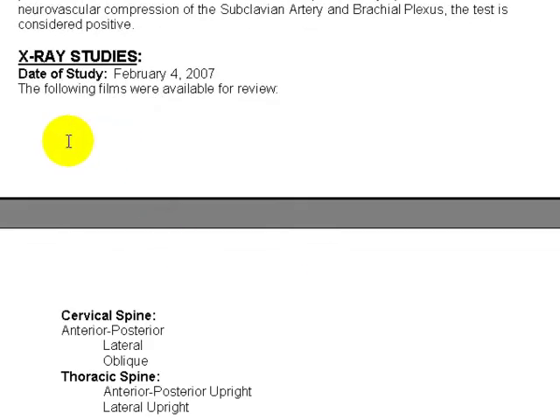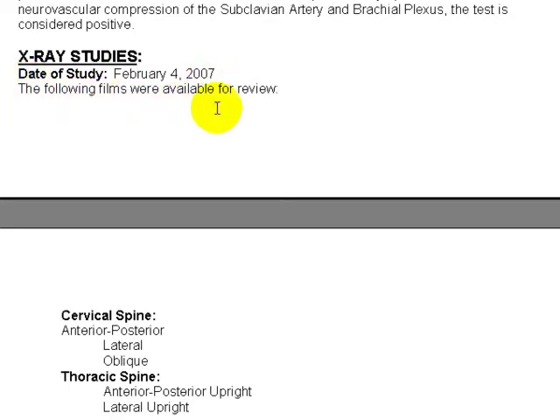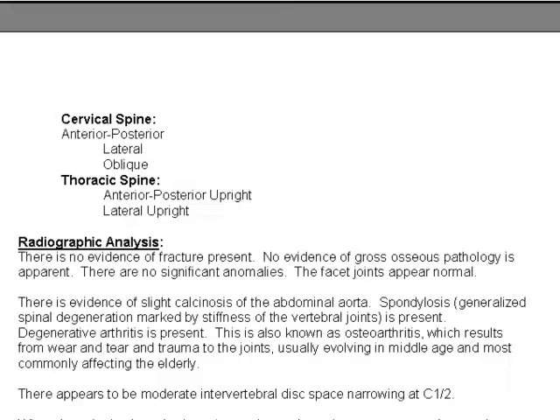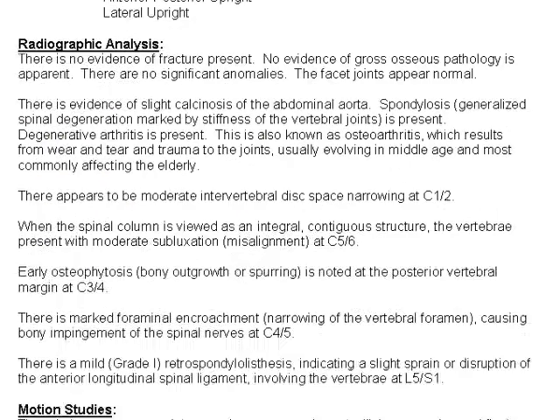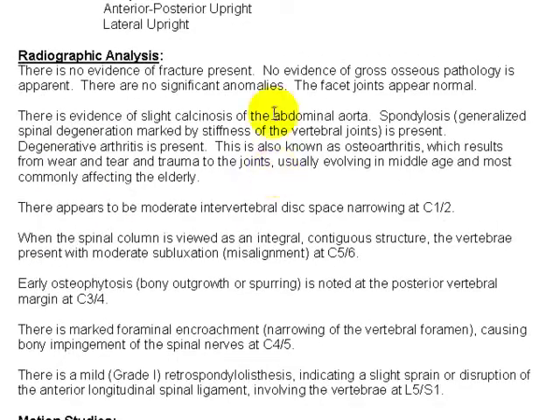And here we have x-ray studies. And this just came straight out of our system from whatever was checked off there. The date of the study, February 4th, the following films were available for review. Here we have cervical. Let me scroll down a little bit here. Cervical and thoracic views. That's what we checked off. And then we get the text of the actual report.